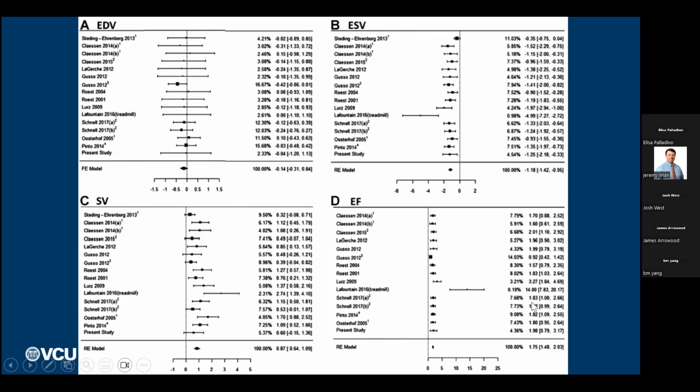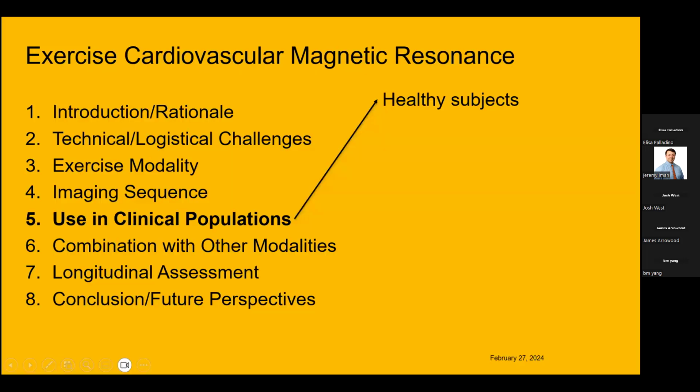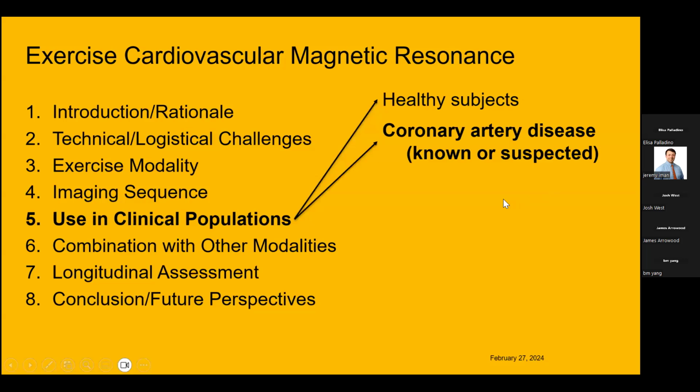Just sort of food for thought in people who are contemplating a clinical or research protocol of their own. If you expect your findings to be subtle, then maybe a treadmill challenge is the way to go after all. Okay, so that's healthy subjects.